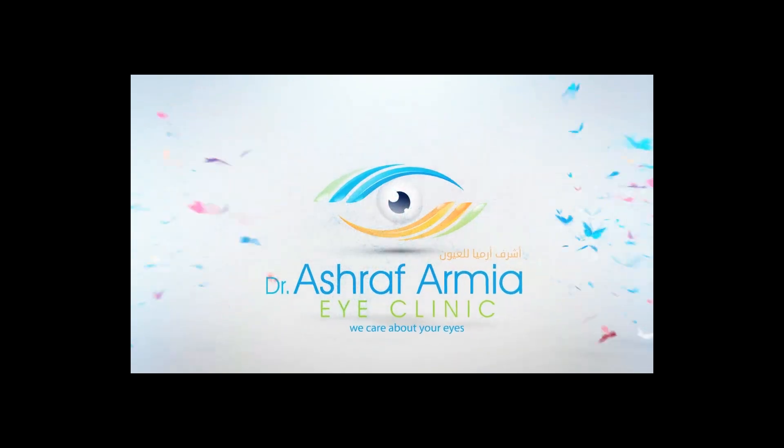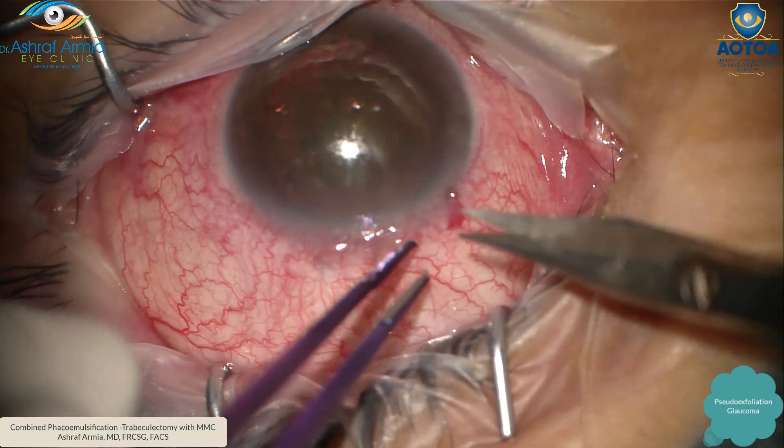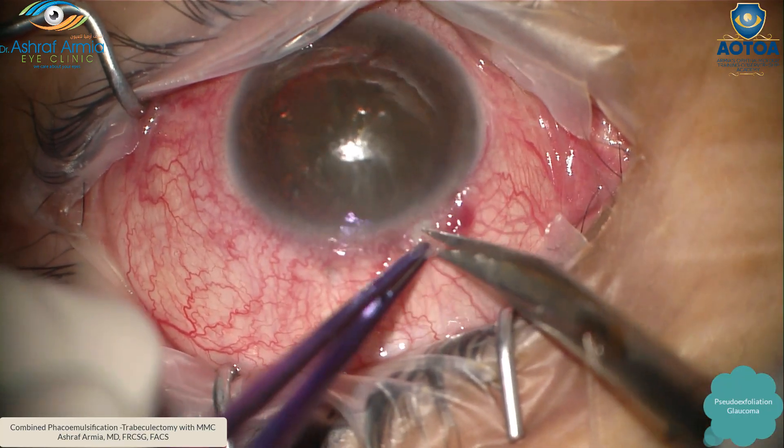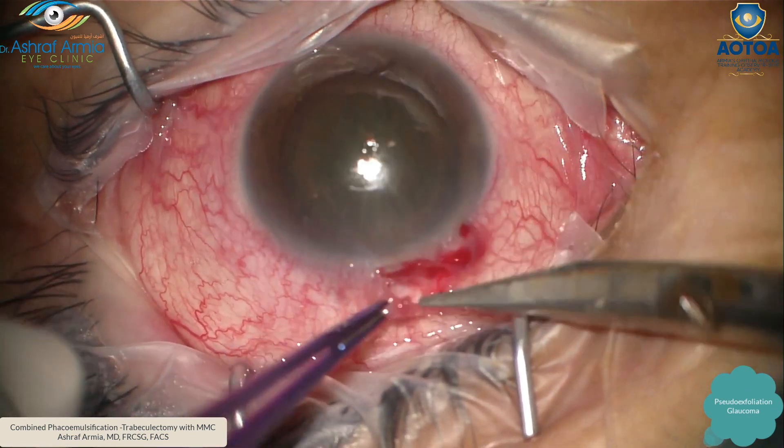Hello everyone. In this video I'm going to describe how we do a combined FACO trabeculectomy in cases of pseudoexfoliation. First, at 12 o'clock, I do a conjunctival snip.